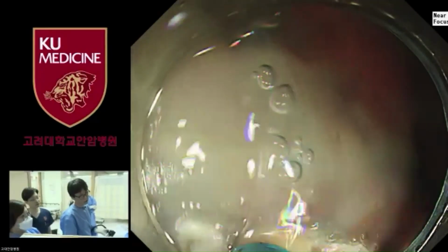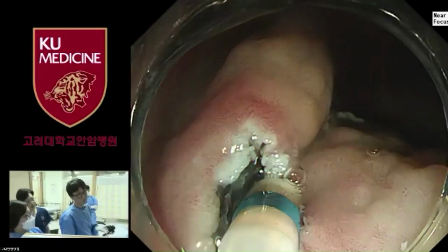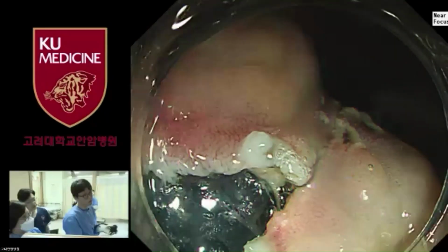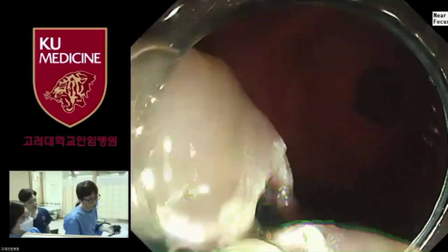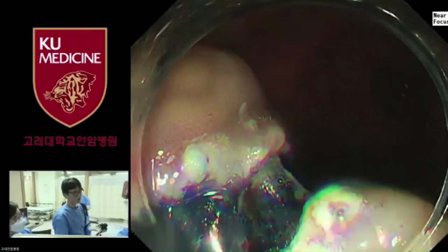And are you injecting while you do the incision, or do you only do the incision without injection? Maybe this is only a dual knife without injection. Okay. This one also has an injection function, so we could inject injection material through the needle into the submucosal layer. That's right, because usually our nurse injects while we are cutting, so you're always creating a cushion.